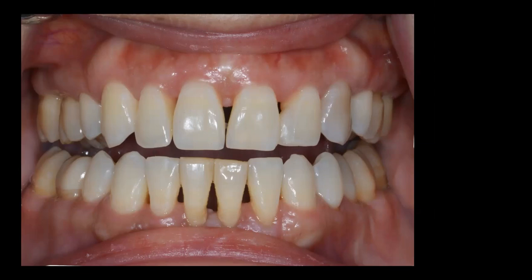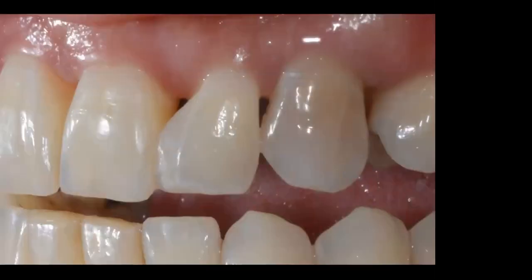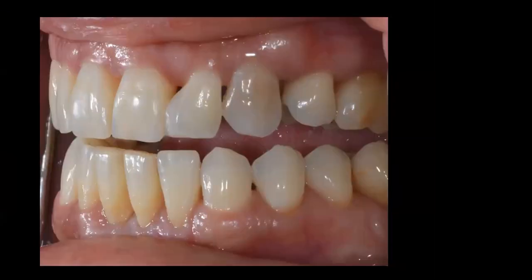Well, this poor dentist did what I did 25 years ago. He took a piece of flat mylar and he closed the space. And you can see that he closed the space, and he was very happy. He was amazed. He says, wow, look, I got a good contact. And he handed the mirror to the patient. This is, once again, the wife of the orthodontist.